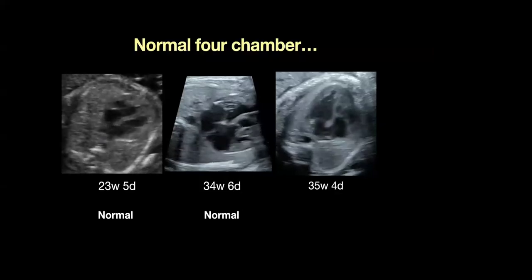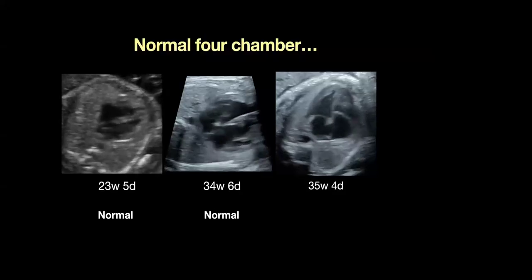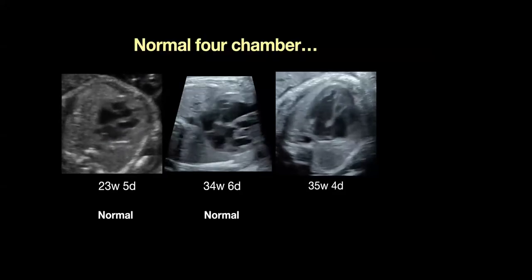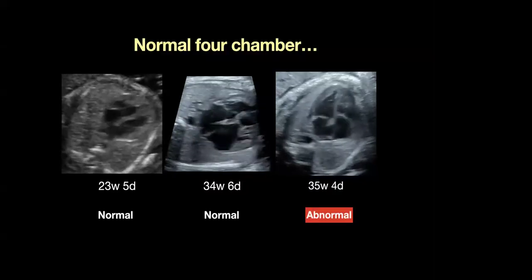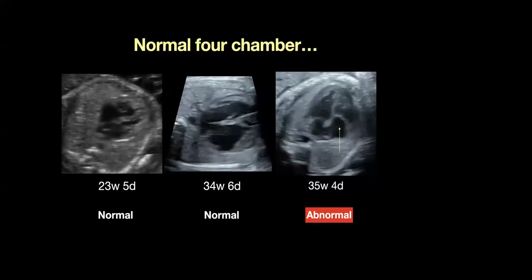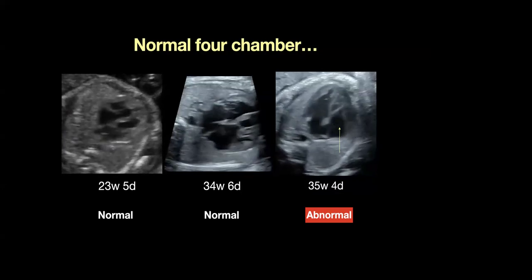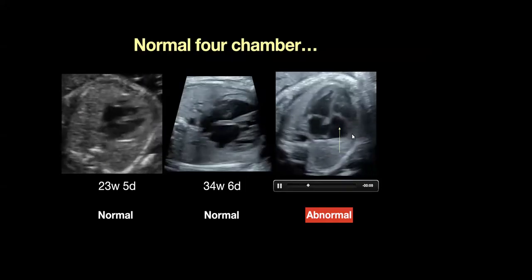So notice how the angle of inclination has changed. We are perpendicular to the areas that are appropriate for us to interrogate. And it's one thing that we noticed that we did not notice previously. Here you could see that there is an abnormal valve insertion, right? So we all know that the tricuspid valve should be more apically offset in comparison to the mitral valve, but this is a bit too much, right?